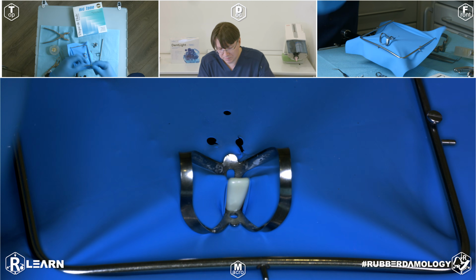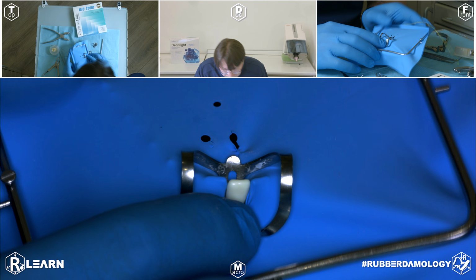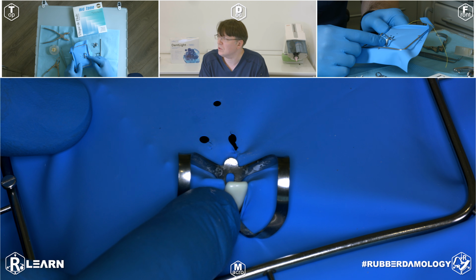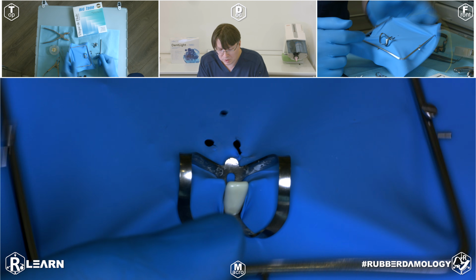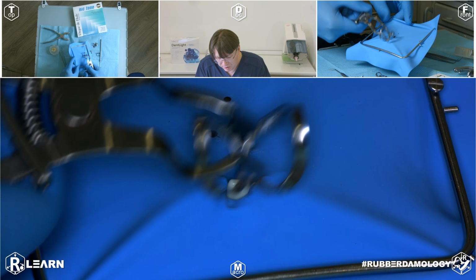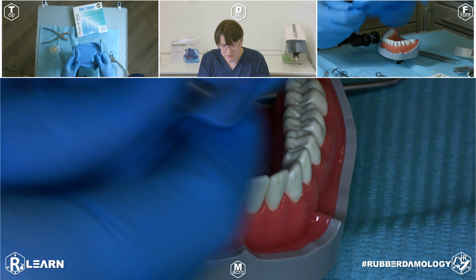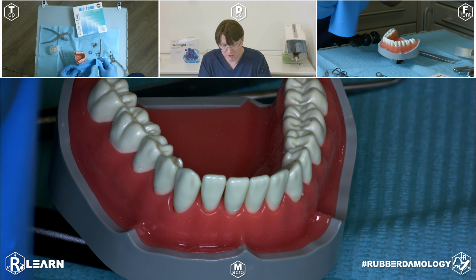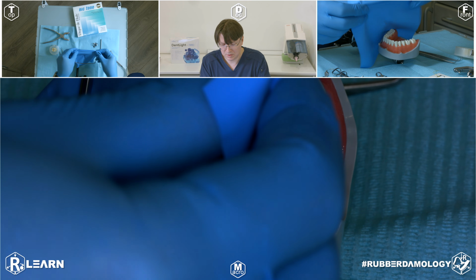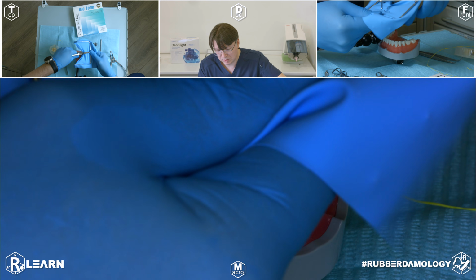You receive very aggressive tension in the interdental space, and maybe you have a small leakage of saliva in the interdental space between tooth number 41 and 42. What can you do in such a way? Let's make another perforation set to solve this issue. I also rotate my rubber dam plate and make 3 perforations for different teeth.